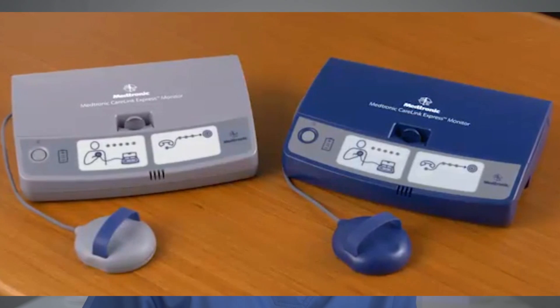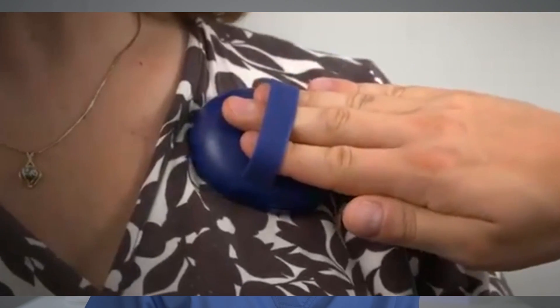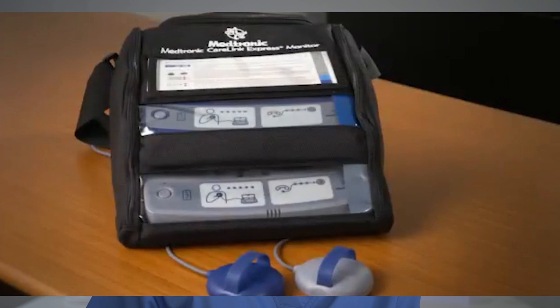For many decades, follow-up evaluation of pacemakers required an in-person assessment for device interrogation on a recurring basis. However, with the progress of technology, most current pacemakers can get comprehensive and safe remote monitoring. Remote monitoring provides alerts in real time, but is not as comprehensive as in-person complete device interrogation. The current recommendation is that in addition to remote monitoring, the pacemaker should be checked in the doctor's office or hospital at least once a year.